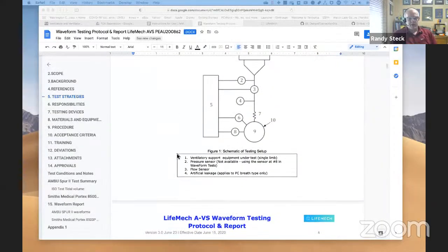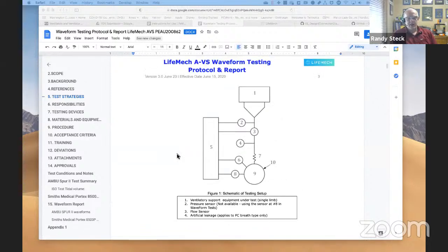So that was actually a pretty involved data collection effort. We ran it multiple times. We ended up trying to understand what the reality of the effect was if a human was attached to it. Now, we've never done any animal testing with this, but we've done the lung simulation testing, and it basically involves a lot of processing of the waveforms and data collection over varying constraints.